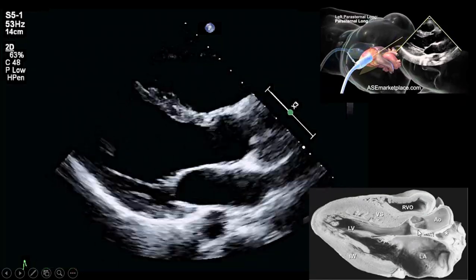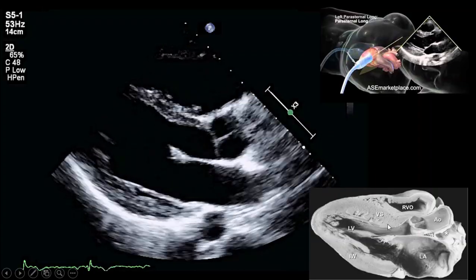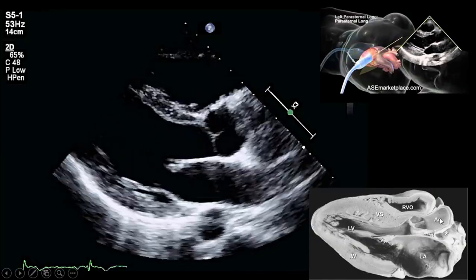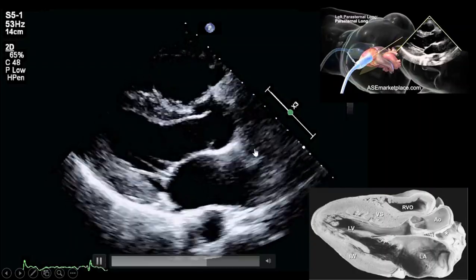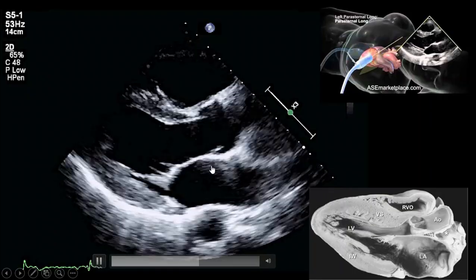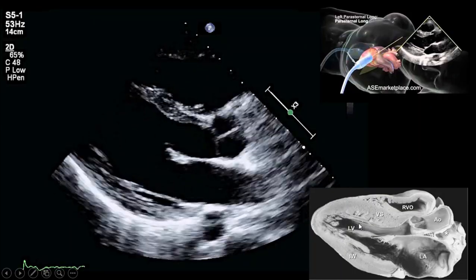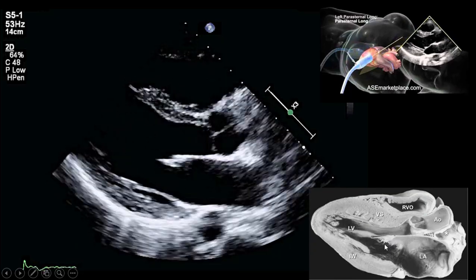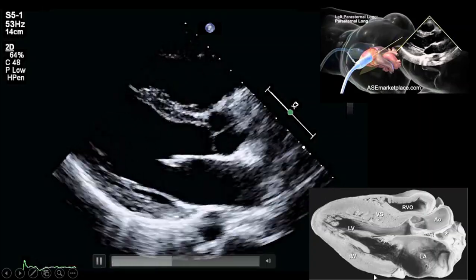So that is the reason. Ultrasound only creates from the cutting surface, not the depth or z-axis of the cross section. That is the reason it looks a little different, but in reality it is the same. Only ultrasound doesn't create an image of those areas because the sound doesn't pass through them; only in this area does the sound pass and create an image from this cutting surface.